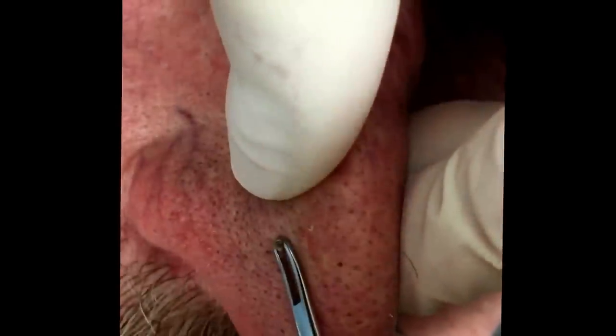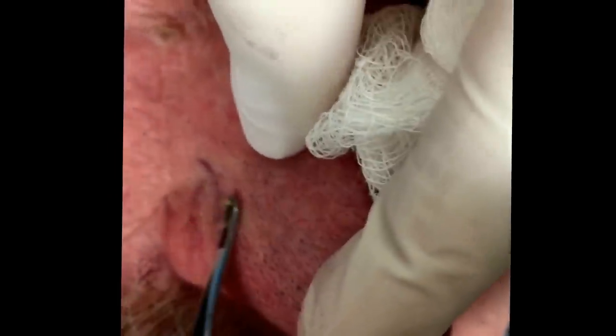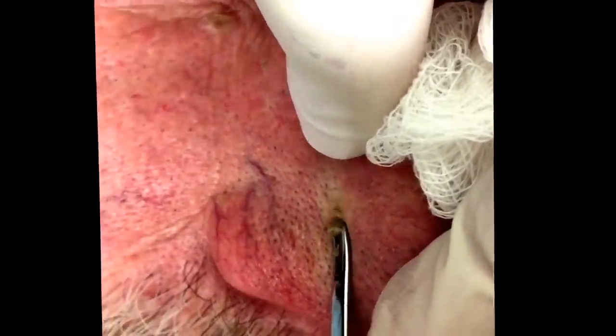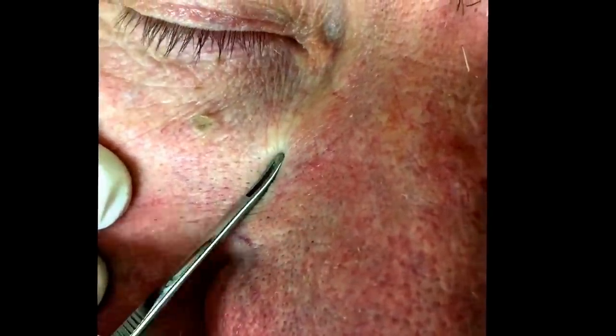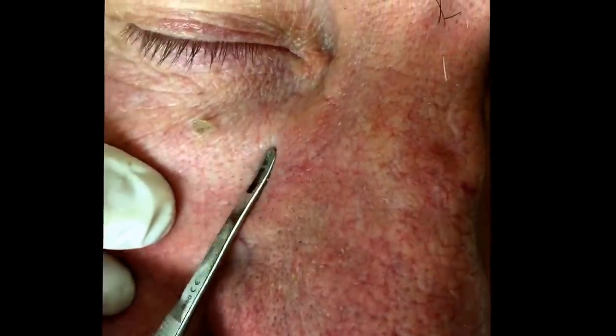Good. As long as you're not pushing — it's not damaging, you're just putting pressure around it. Sorry, are you okay? Almost done. Even when you do your nose like this, if you just push — see how lightly I can push against it? I'm really kind of... you know, she should be paying me to do this. You have a couple over here that we won't go to because I don't want to torture you anymore. Let me see if I can get this one lightly with a little pressure. That one I need to extract so it won't do that to you.